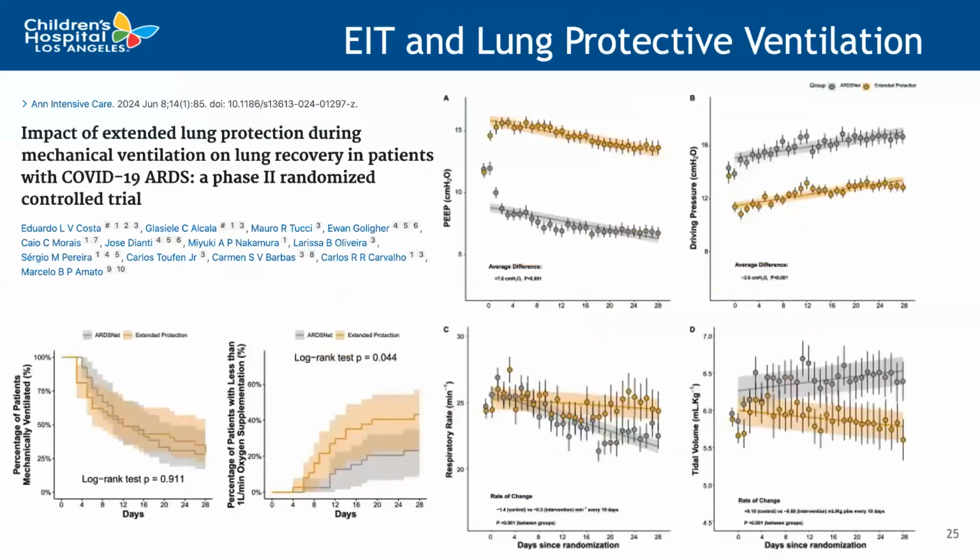And so how is EIT helpful in guiding these lung protective ventilation strategies? The same group that we'll talk about later in the study out of Brazil, Dr. Costa and Dr. Amato, they are leading the charge with a lot of this EIT research. And they actually performed a phase 2 randomized control trial during the COVID-19 pandemic, in which they randomized patients to a more conventional strategy of following the ARDS guidelines, and then that strategy that was using EIT guided management.